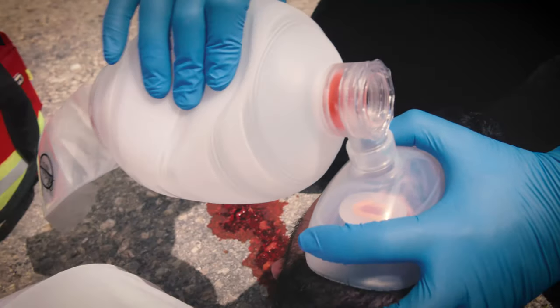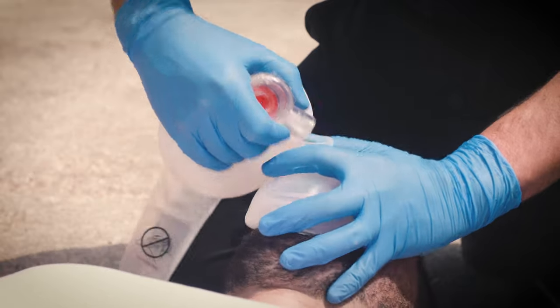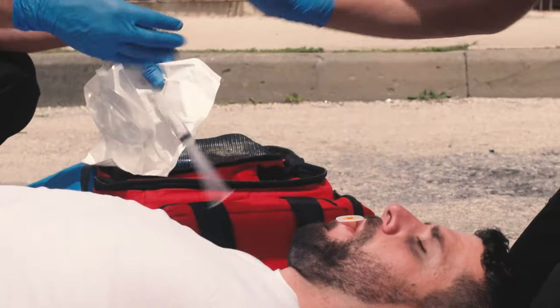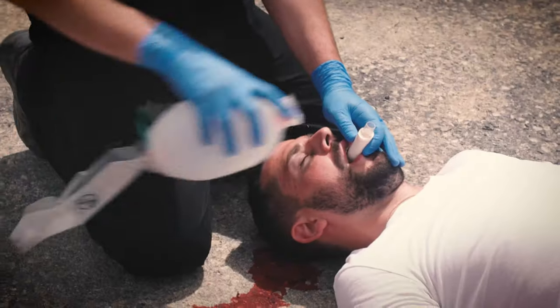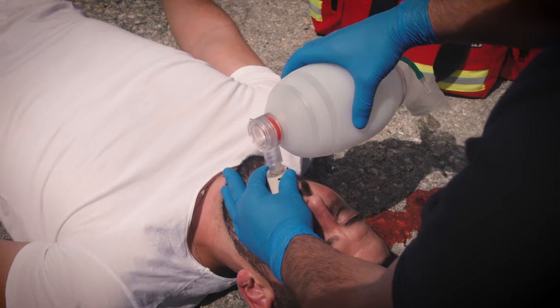It features a highly transparent mask providing a clear view of the patient's mouth and nose, and is made from the highest quality materials for flawless performance.